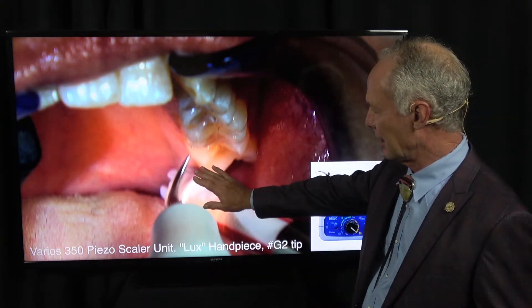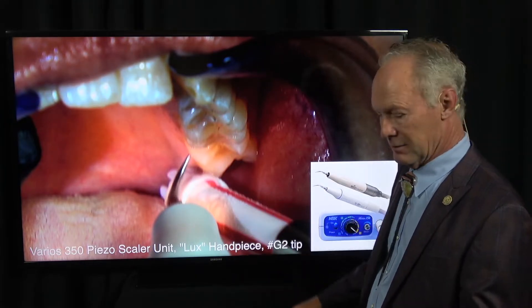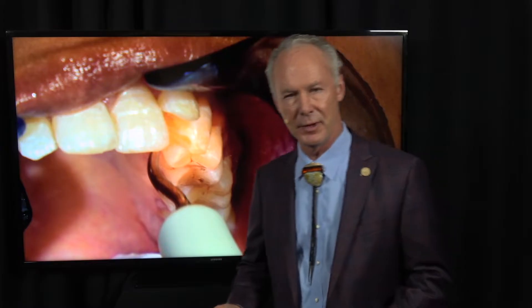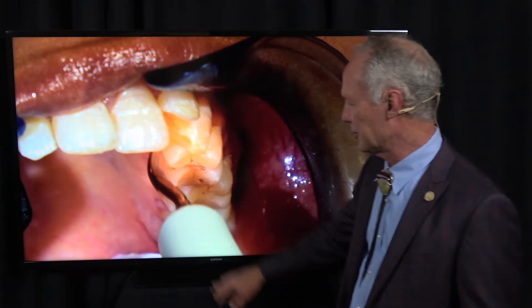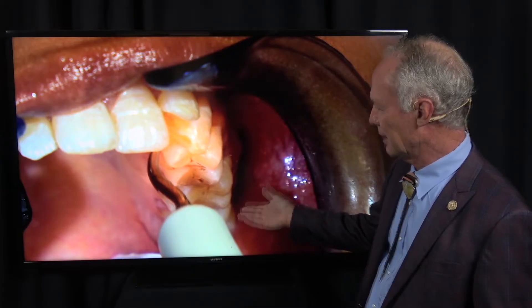I begin with the ultrasonic scaler. At the first appointment, I'm doing gross debridement, primarily with the ultrasonic — lots of water, just getting the gross calculus, plaque, and stain off the teeth. Then the patient will return for a second appointment with my dental hygienist, who will do fine scaling and oral hygiene instruction. At this appointment, I'm doing gross debridement with the ultrasonic, then coming back for scaling and root planing, flossing, and polishing — light touch, lots of water.